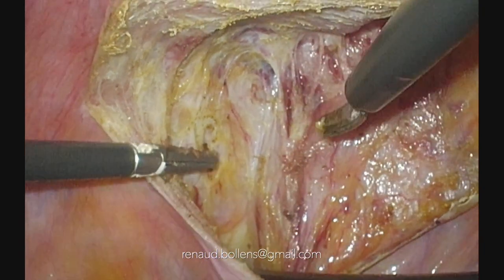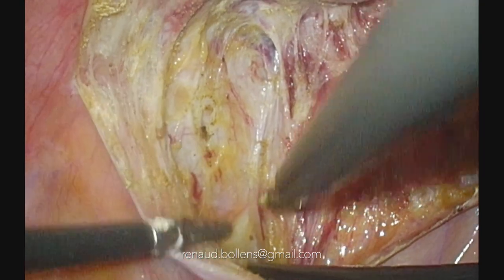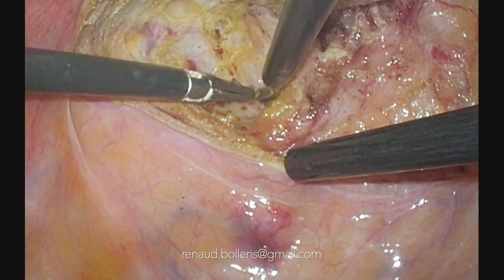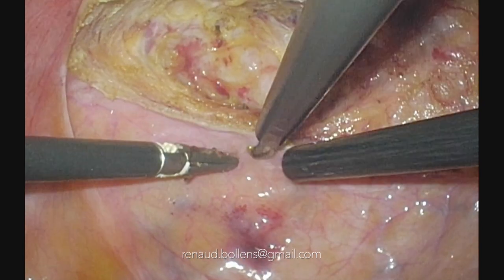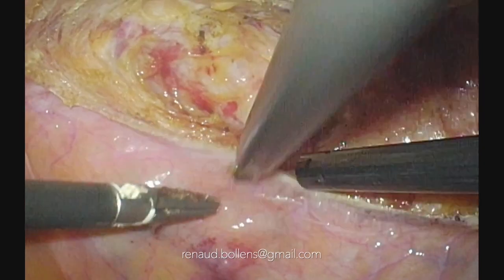Basic techniques, if you want to do blunt dissection, we can increase the number of tractions. Release a little bit the suction. Release. I want to do a blunt dissection here laterally along the muscle. If I use two directions of traction, as you can see, it's not really efficient, because when I push laterally, the tissue is compensated with the movement up. Then I push laterally and the tissue is moved up.